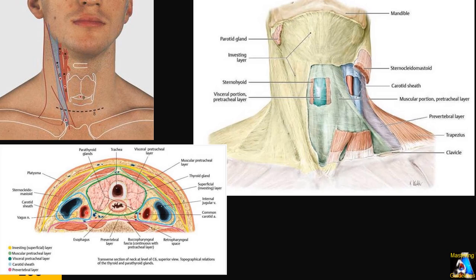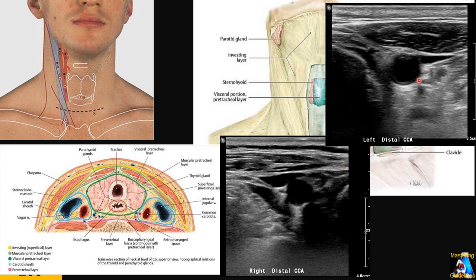Between the carotid and internal jugular vessels, you can appreciate the vagus nerve, which in ultrasound looks like a honeycomb pattern. Here is the left cross-section and right side on ultrasound. You can see the upper part of the thyroid gland, internal jugular collapsing, sternocleidomastoid, and the common carotid artery close to the distal portion. Beyond that you don't see any structures because of the thyroid cartilage, which doesn't let sound pass through.